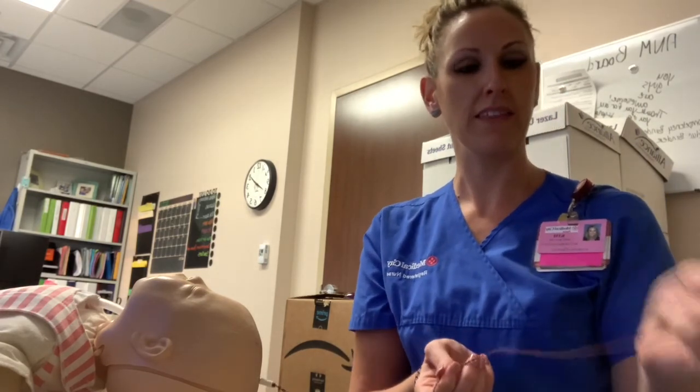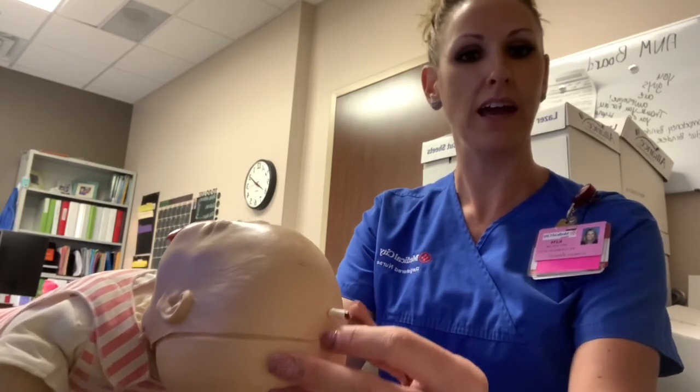You're going to take the end, you're going to hook it up into the cable, and then you're going to make sure that you have the accurate fetal heart rate. Once you have that in place, you can secure it to the leg, and then you can continue on and do your documentation.